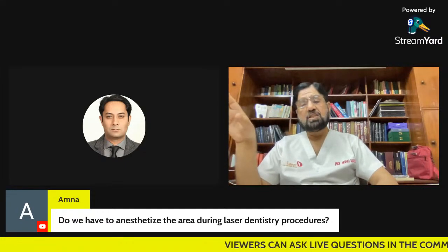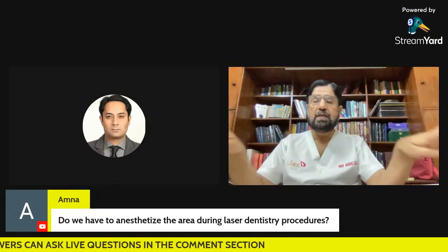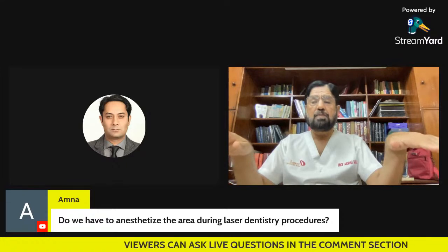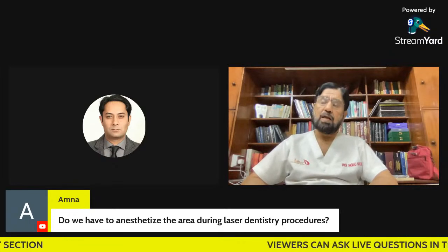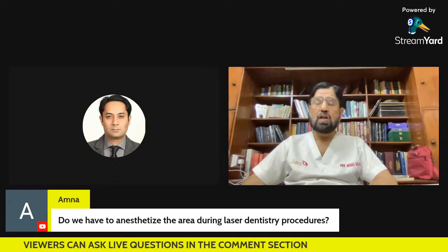Up to the epithelium, or up to the lamina lucida and lamina densa, the laser application is without any type of anesthesia. It soothes the peripheral nerve endings, and sometimes there is no need of any anesthesia. I have done many frenectomies and surface ablation of certain scars without any local anesthesia. Local anesthesia is only required when you are going to make a deep cut, and that is sometimes required. Otherwise, surface application of the laser doesn't need any type of anesthesia.